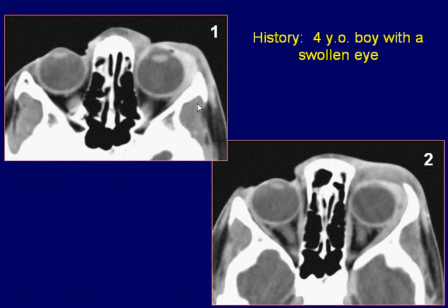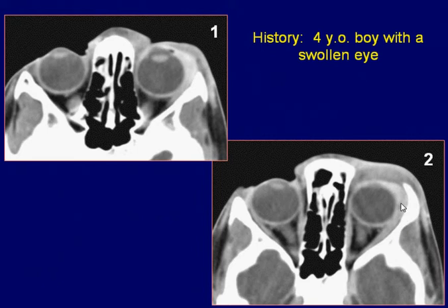A four-year-old boy with eye swelling. Axial post-contrast CT scan of the orbit shows swelling and enhancement of the preseptal soft tissues of the left orbit. The abnormality extends posteriorly lateral to the globe, involving the lateral extraconal space and lateral rectus muscle. The left eyeball appears not to be involved.